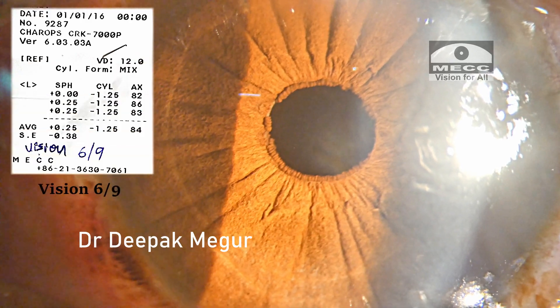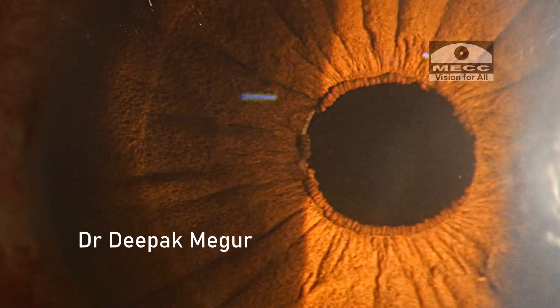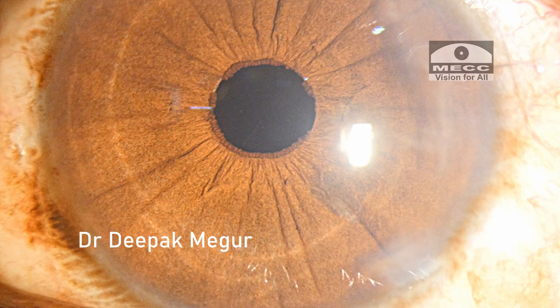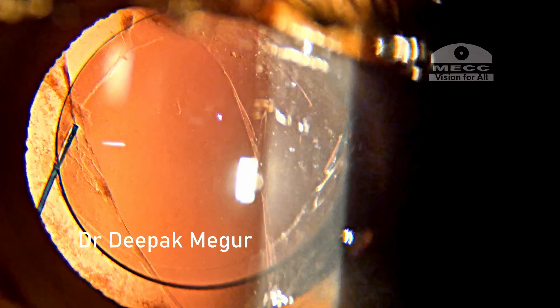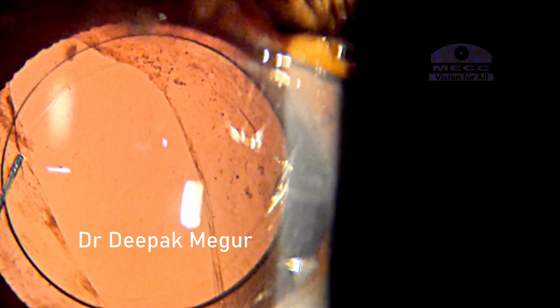This is the next day. The cornea is clear with no inflammation — we do have a happy patient. After two weeks, a dilated retinal evaluation is done, which is repeated after six weeks. The patient continues to do well.